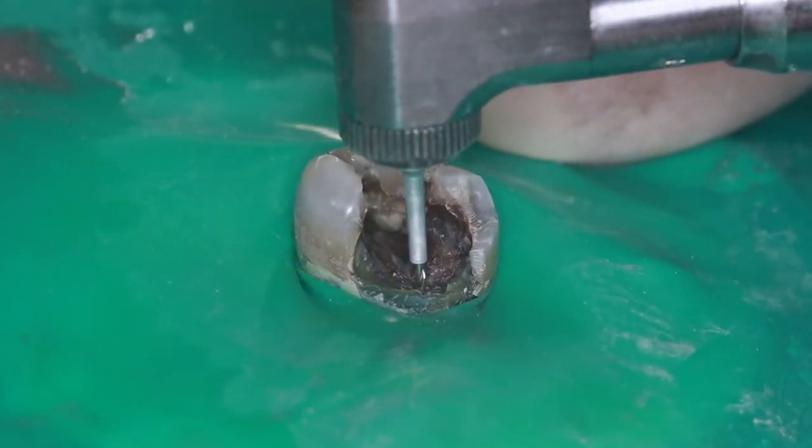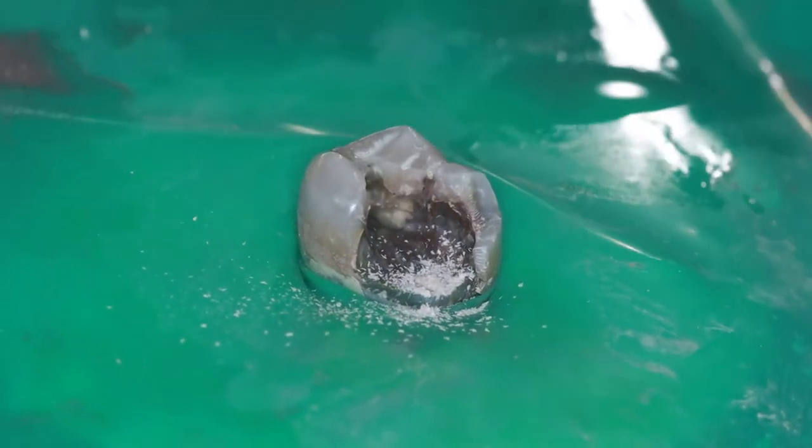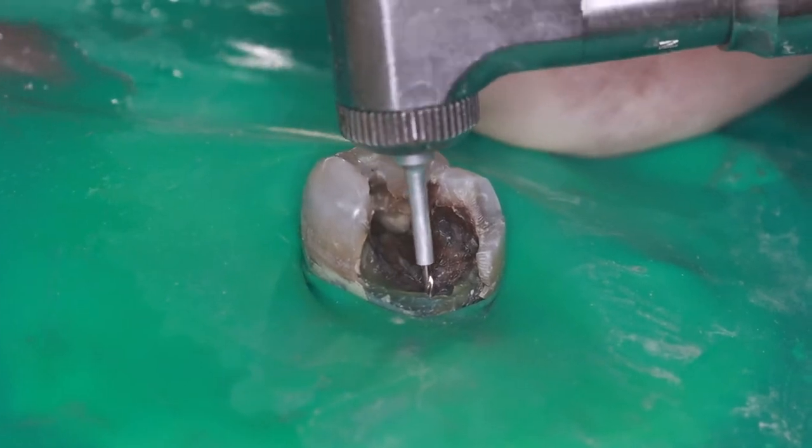Then I place the drill in the pilot hole and hold it at the proper angle. I don't want to angle it toward the nerve space of the tooth, and I don't want to angle it towards the side of the tooth, which could lead to the drill hole coming out the side. So I pick an angle that is down the root of the tooth, and I drill my hole.